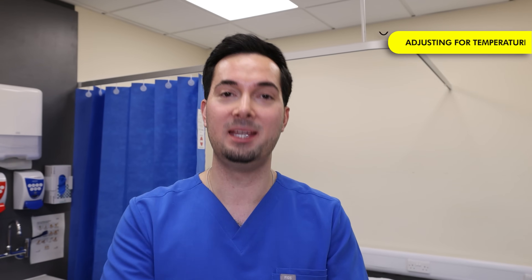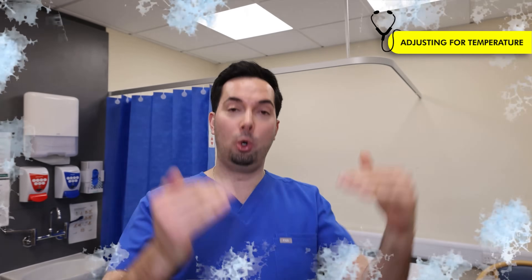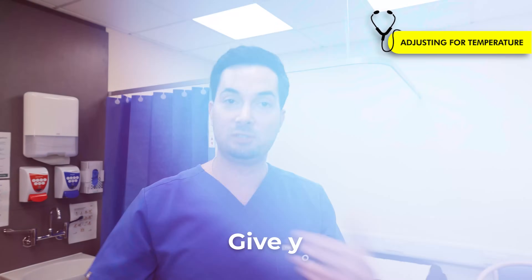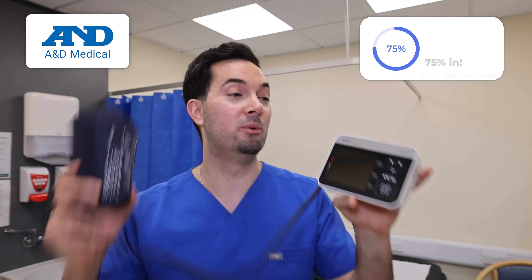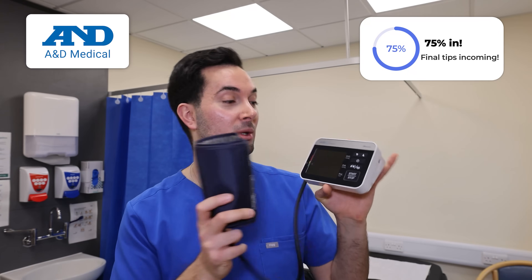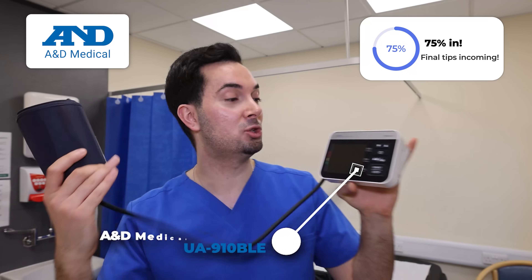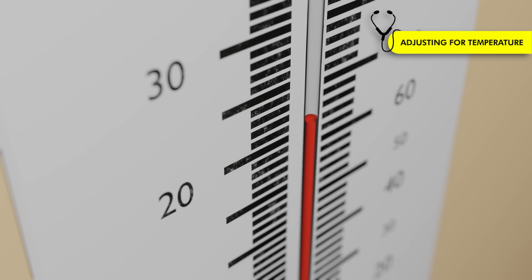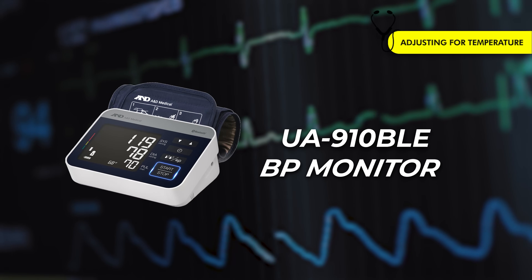Step five — and this is one many people don't know about: temperature can affect your blood pressure readings. Colder temperatures cause blood vessels to constrict, which temporarily increases blood pressure. If you've come from a cold environment, give yourself time to acclimatize to the room temperature before taking a reading. The same applies if you've come in from heat. The UA-910BLE actually records the ambient room temperature when you take your reading, helping you better understand any outliers in your results.